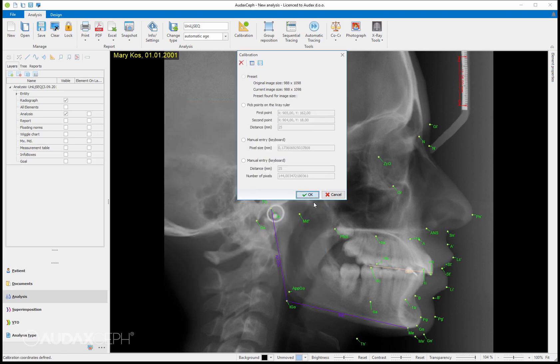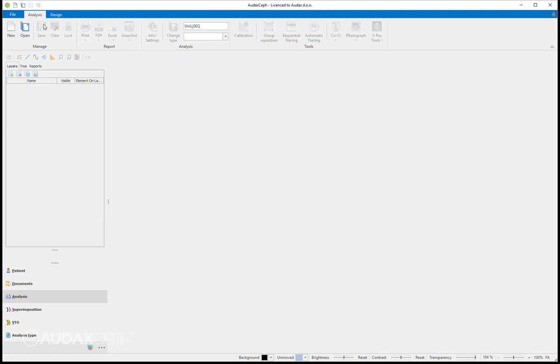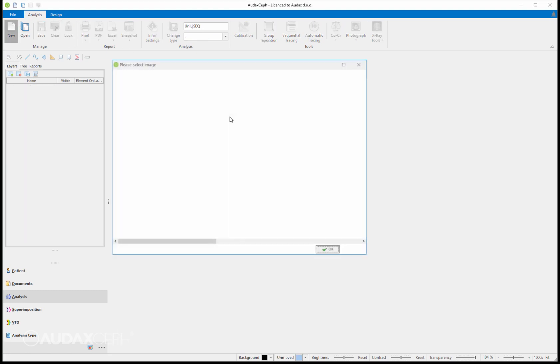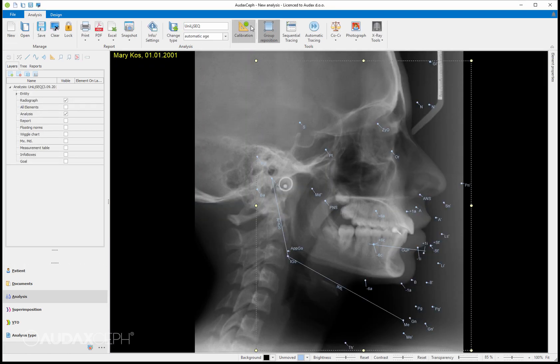The next time that I open this analysis or another analysis, for example, I'm going to clear that and create a new analysis out of this image, and you will see that it's already calibrated. So this step does not need to be done again. I hope that this explains how calibration works. If you have any more questions, just let me know.